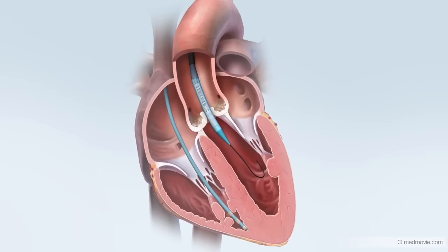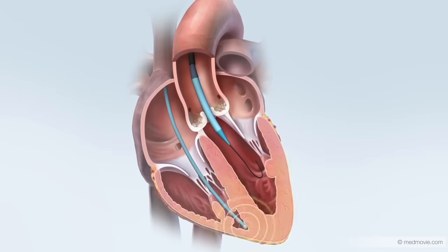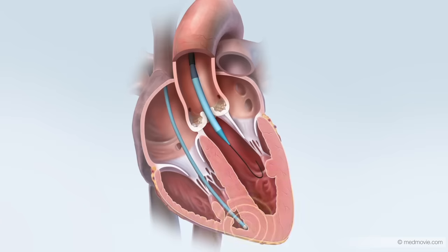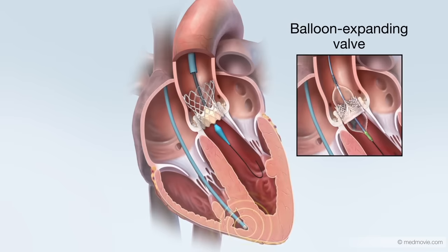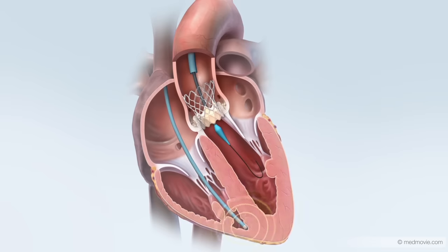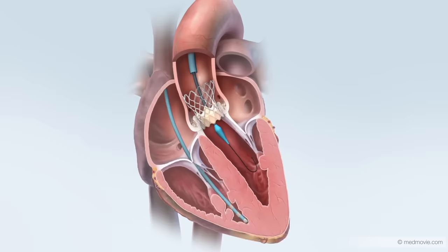Once the physician has the new valve positioned correctly within the diseased valve, the heart is sometimes paced. Pacing makes the heart beat so fast it cannot pump blood for a few seconds, thereby allowing safe and effective valve deployment. To deploy the valve, two techniques are commonly used: in one, the catheter is pulled back and the valve expands into place, and in the other, a balloon expands the valve. After valve expansion, pacing is turned off and the heart beats normally.